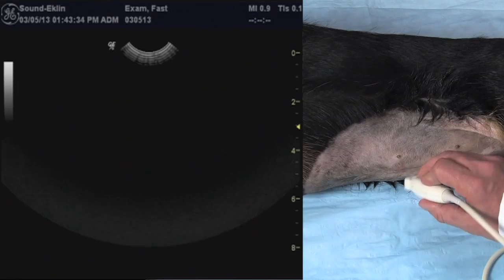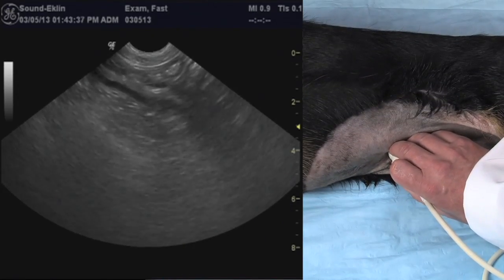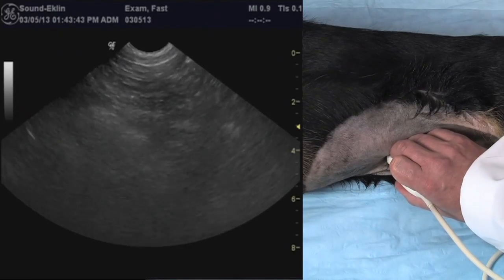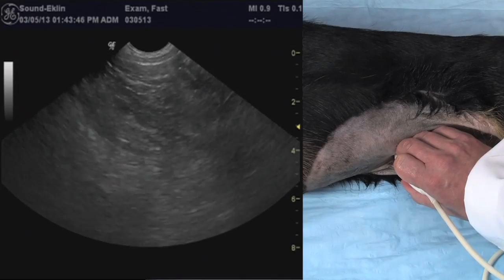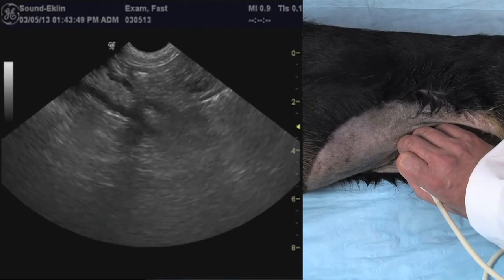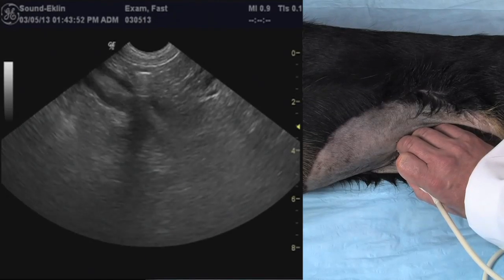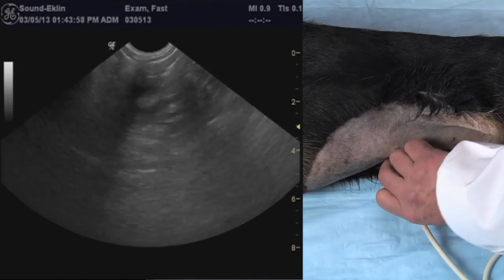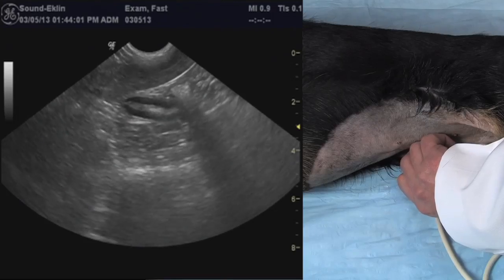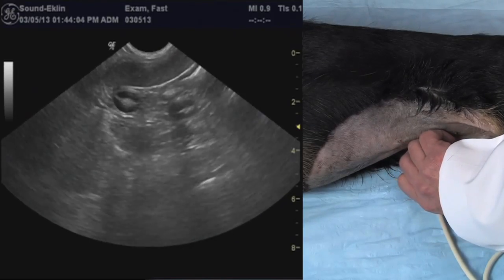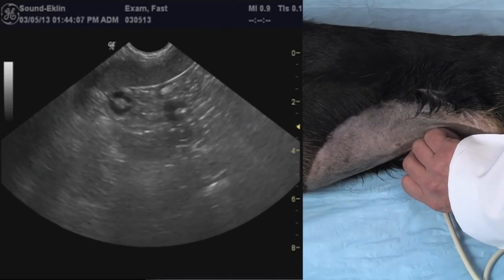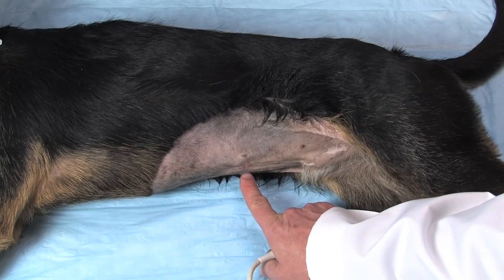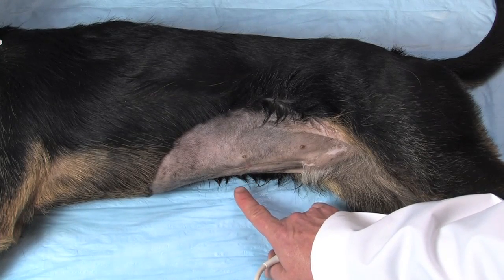Our final site is the home run site, the HR view, where neither target organ is imaged directly. Here often we'll see loops of bowel and sometimes the spleen, but rarely ever the liver unless it's very enlarged. In this view you can see small bowel with its contents moving to and fro in the middle of the image. However, we're just fanning through this region looking for any evidence of free fluid. This dog is negative. The home run site completes the AFAST scan, and at this region often this is where abdominocentesis is going to be performed to characterize the fluid.